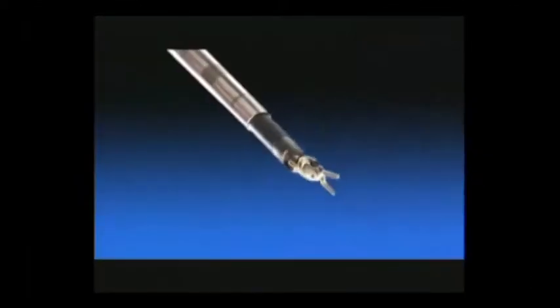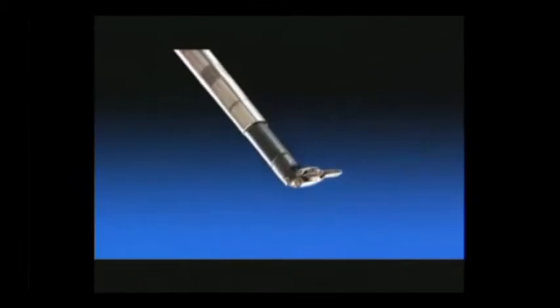The problem with the prostate in men is that they have a very narrow pelvis, and it's deep down in that hole that one has to dig out the prostate gland. So you put your hand there, there's no space to see anything in there. Now the robotic arm, as you will see, is very slim, and instead of the whole arm being there, it's just a little pencil type of thing which goes in, and then the surgeon can manipulate it.